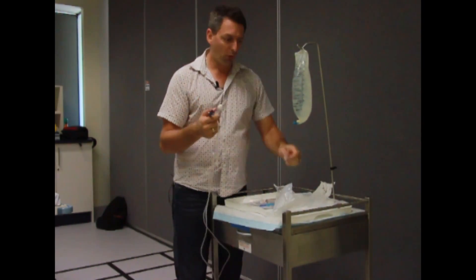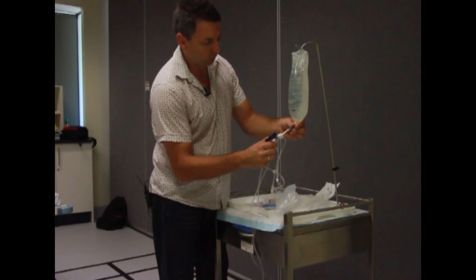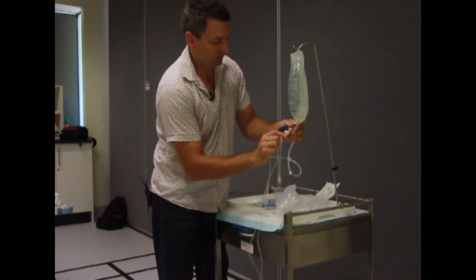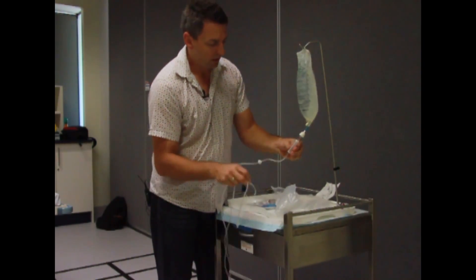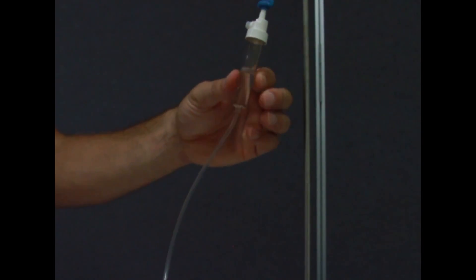Take your cap off using non-touch technique. Hold the giving set in one hand, your bag in the other, hold the port still, and push and twist at the same time. There's a little indicator to tell you how far to push in. Give the chamber two or three squeezes — you want about half a chamber full of fluid, because otherwise you'll get air through it.